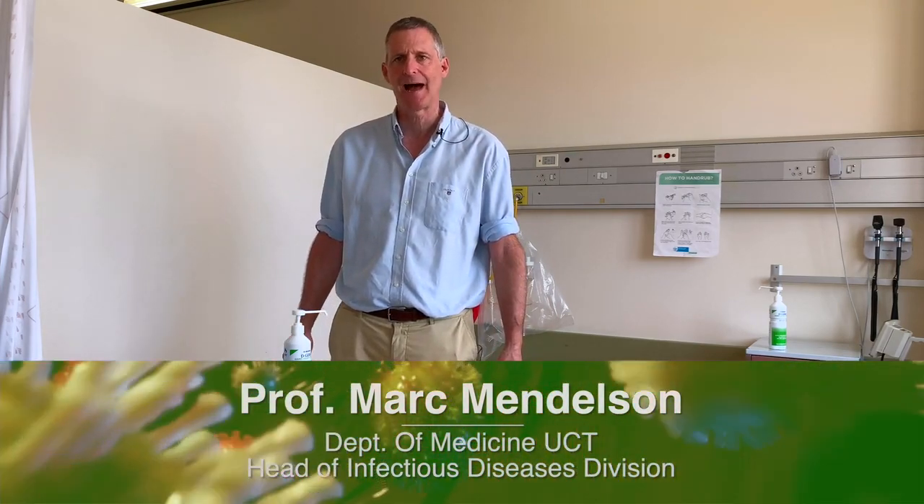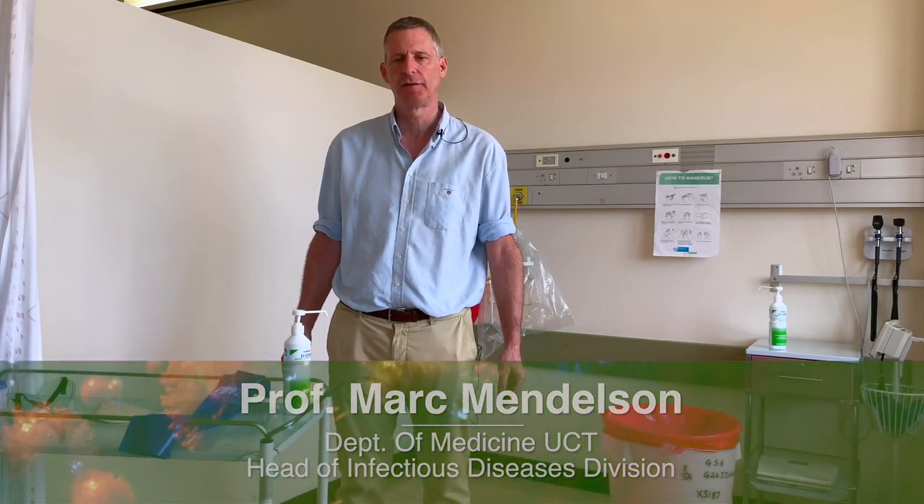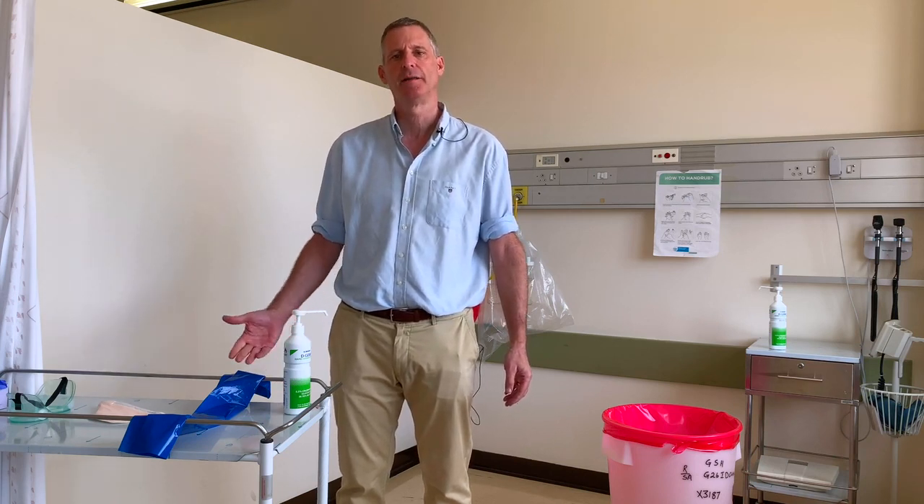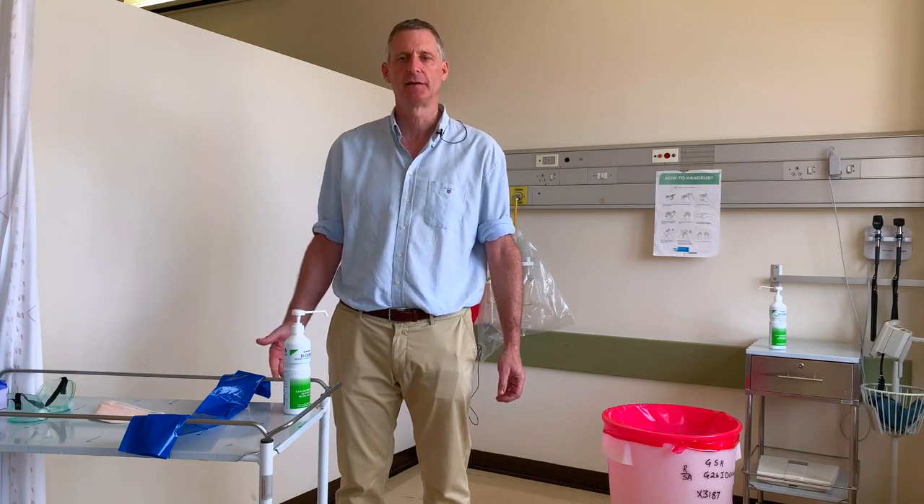Hello, my name is Mark Mendelsohn. I'm an infectious diseases doctor and today I'm going to show you how to put on and take off personal protective equipment when you're looking after a patient with COVID-19. We also term this donning — the putting on — and doffing — the taking off.